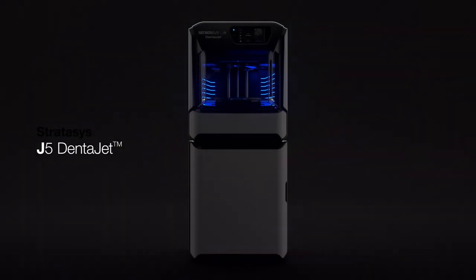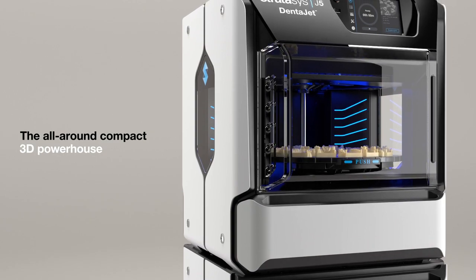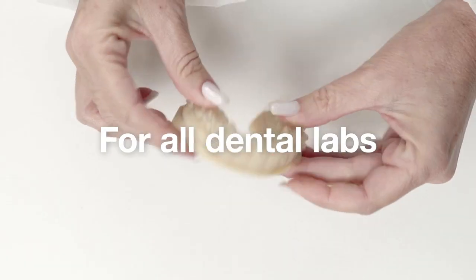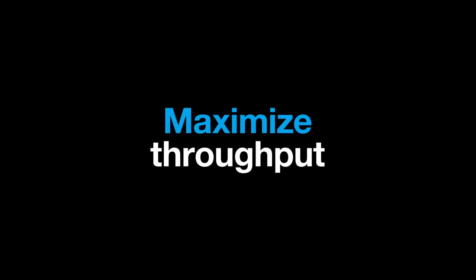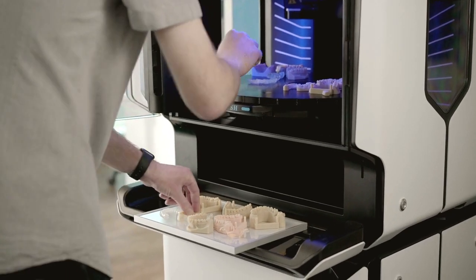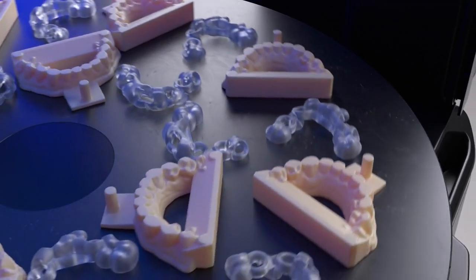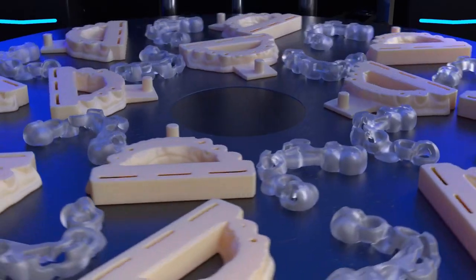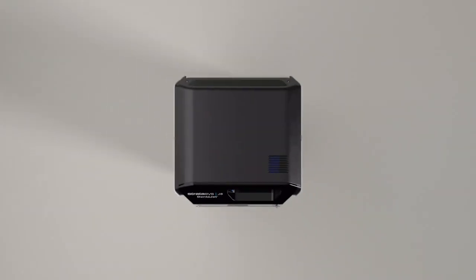Introducing the Stratasys J5 DentaJet, the all-around compact 3D powerhouse for all dental labs. Simplify your production and maximize throughput with precise unattended mixed tray printing. Our 360-degree rotating build tray allows you to print in multiple materials at the same time, giving you maximum output in the smallest of footprints.